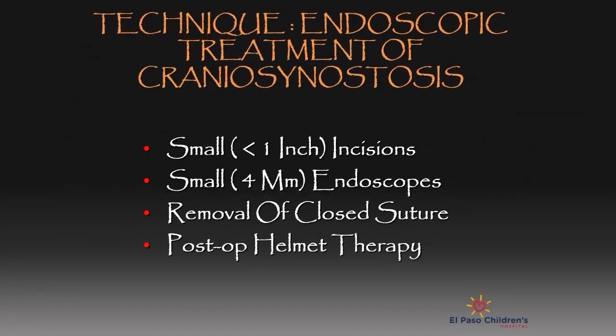The techniques are relatively simple and involve the use of one or two small incisions, the use of rigid endoscopes for excellent visualization, the removal of the stenosed suture, adequate hemostasis, and post-surgical helmet therapy.